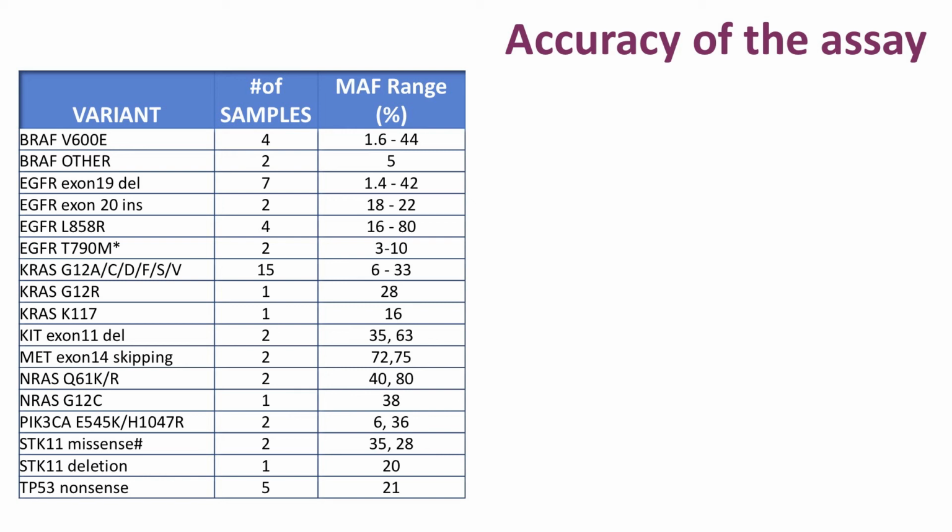There is an error correction in there that I believe is really good for detecting large indels, as you can see. Fortunately, for what we do in large panels, the largest indel that we do is an EGFR indel, or we actually do duplications in the KIT gene, and it works really well for what we did there.